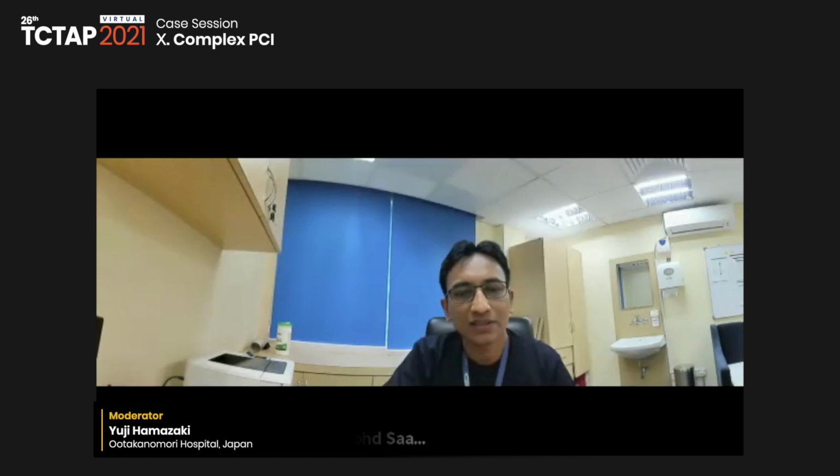Thank you. Nice presentation. This case was very difficult because of severe calcification. Yes, but you could get success using the ADR system. Sure. Any questions or comments from panelists?